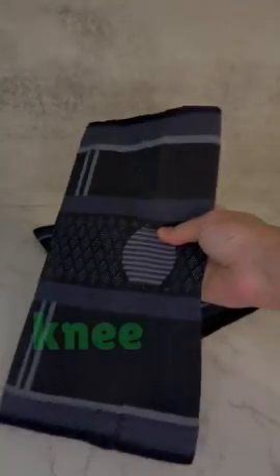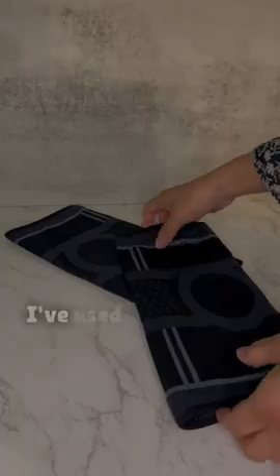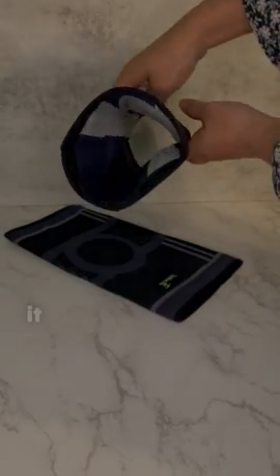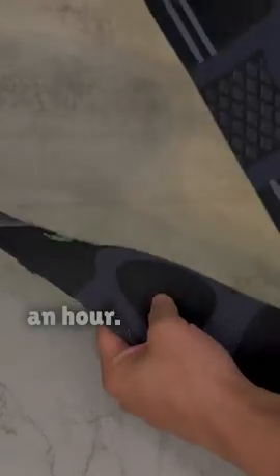I got these knee compression sleeves for some knee pain I was having. I'm a size small for reference. In the past, I've used basic compression sleeves without any padding, and while they were okay, it wasn't great. I'd still feel discomfort, especially after wearing them for an hour.